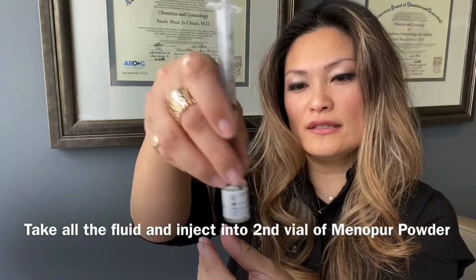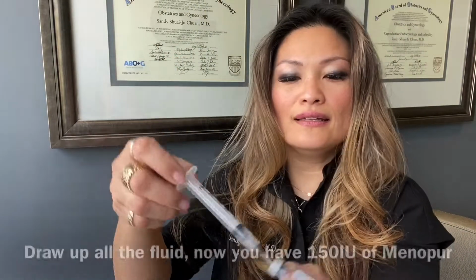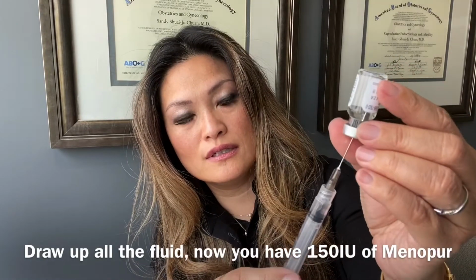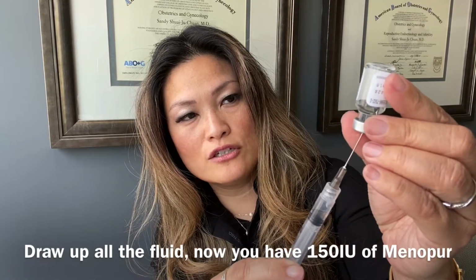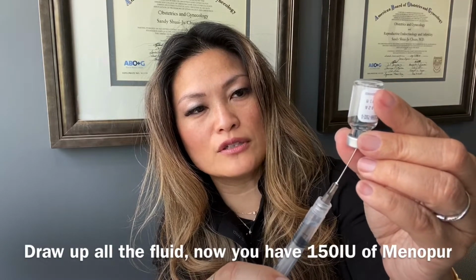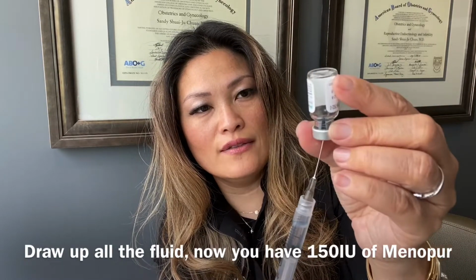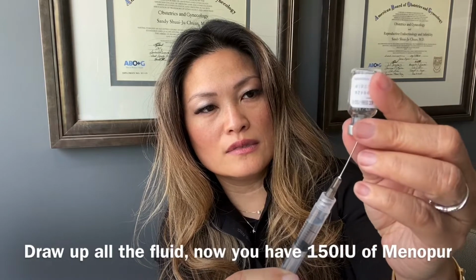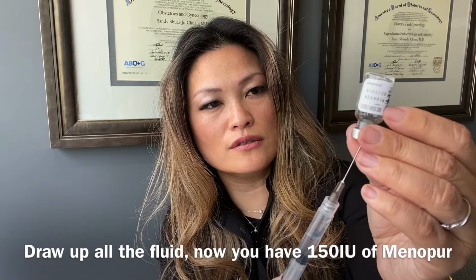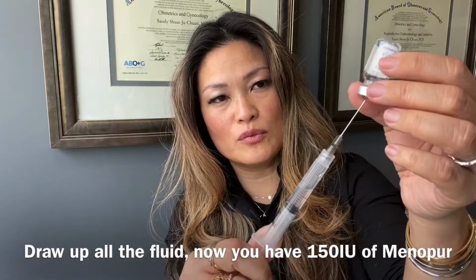Okay, gently swirl it, and then turn it upside down again, just like we've been doing, and then just pull out all your medication, all the liquid, every last drop if you can. Sometimes you're going to have a tiny little drop left in, and that's okay. The manufacturer kind of accounts for that. You're going to lose maybe a little bit in the bottle, okay? But try to get as much as you can, even if you're pulling out air.